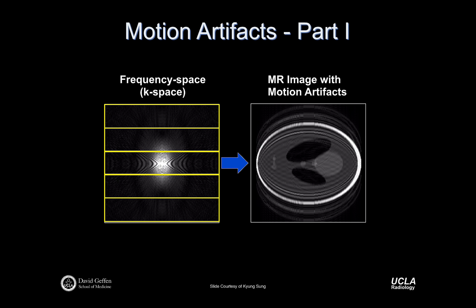The other thing you can do is you could look at an image like this. I don't know if you'll need this on Wednesday, but when you're in lab on Wednesday, it can help you identify what's the phase and frequency encoding directions. Right? So if you were just given an image like this, you'd have a pretty good guess that frequency encoding is left-right and phase encoding is up-down. And so it's one way of getting some insight to the acquisition that was acquired.